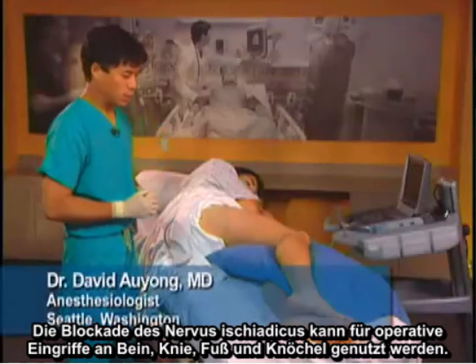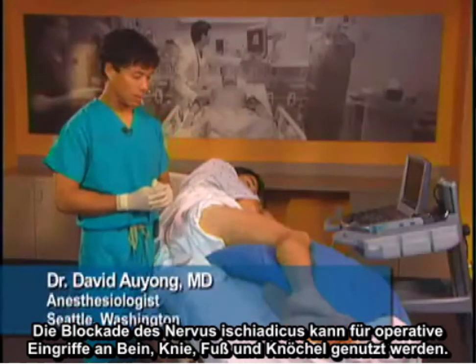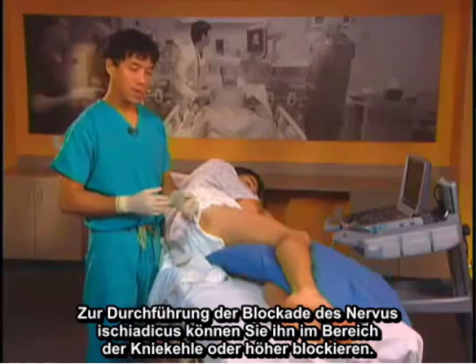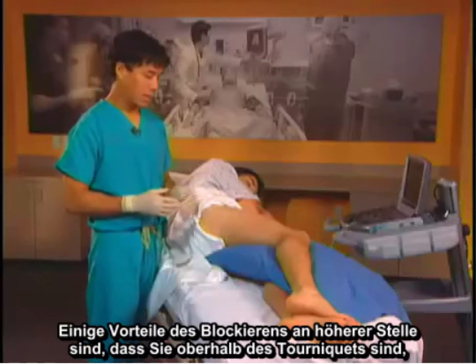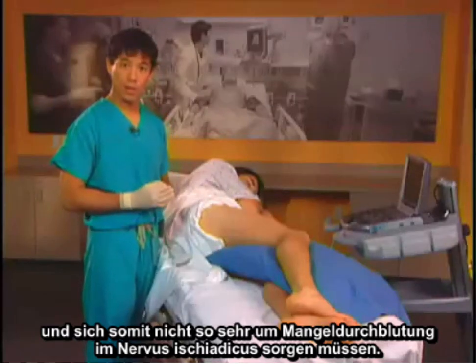The sciatic nerve block can be used for surgery of the leg, knee, foot, and ankle. To do the sciatic nerve block, you can block it at the popliteal region or you can block it higher. Some benefits of blocking it higher are to be above the tourniquet, so you don't have to worry so much about nerve ischemia.